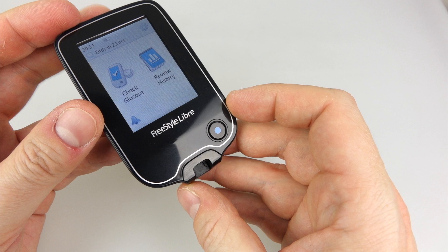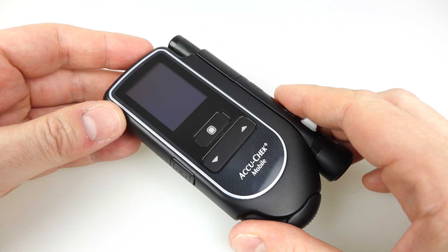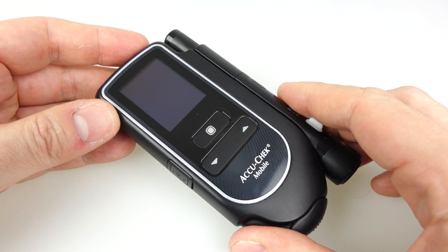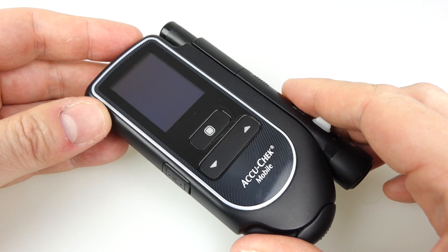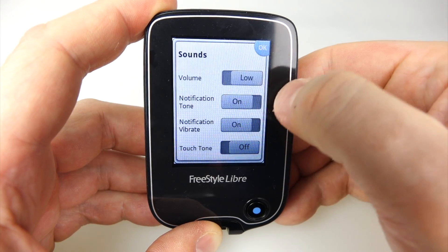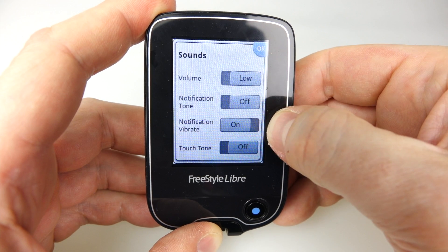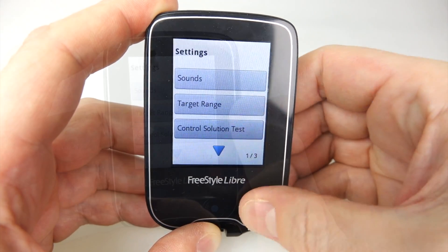The Freestyle Libre does have a traditional testing strip mechanism on the bottom — I haven't got any strips for it, but I do keep a separate device so I'm still using the AccuCheck Mobile when needed. I have checked it against the Libre just to verify accuracy and it's always been very accurate. The only time you'll really need a blood tester is during a really low hypo — at that point the Libre can't tell you exactly how bad it's got, so you do need to test blood for that. I use it with the sound off and just a vibration so I can tell when I've got a reading without annoying everyone in the office.